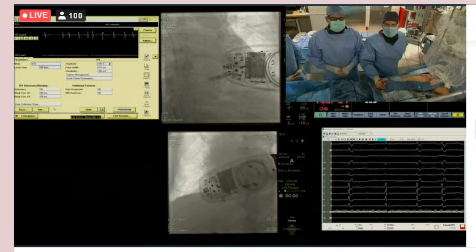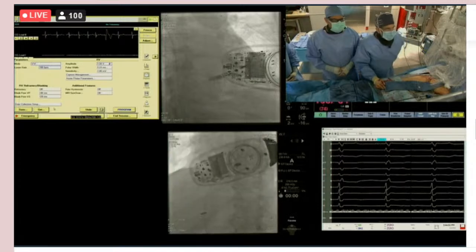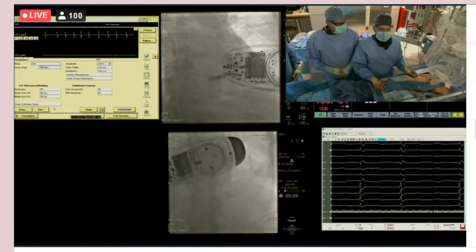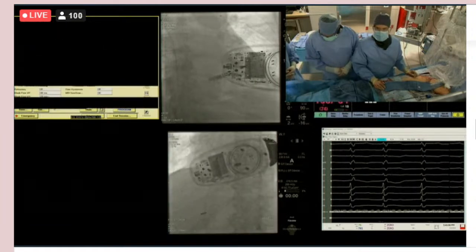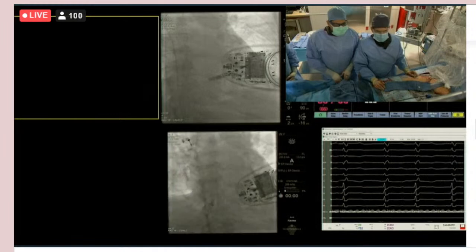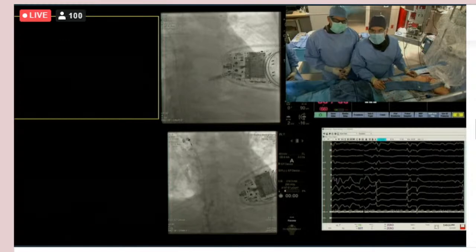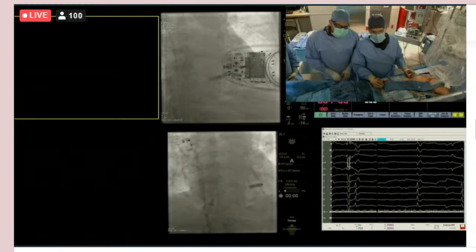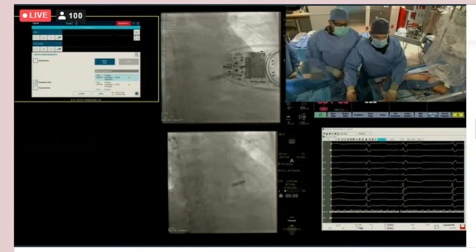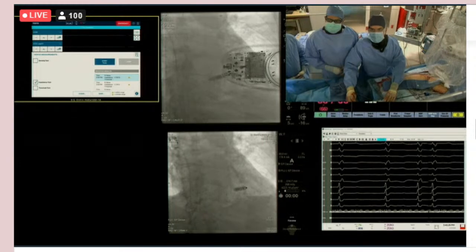Yeah, 3.5. Got it. And you have not done a tug test yet, so it sounds like this may not be an optimal kind of position. Yeah, the impedance is way too high. Okay. 1700, which is a little nerve-wracking to me. Take that thing out. Can you take your programmer off? So you're still tethered, so you're just going to advance and kind of pop it out. What's that? You're just going to advance and pull it out at this stage. Yeah, I just don't want pressure.